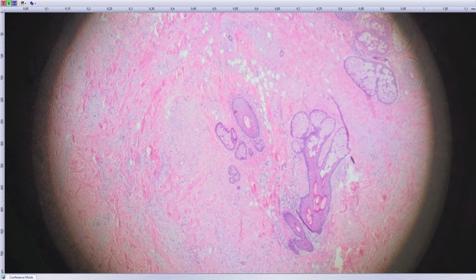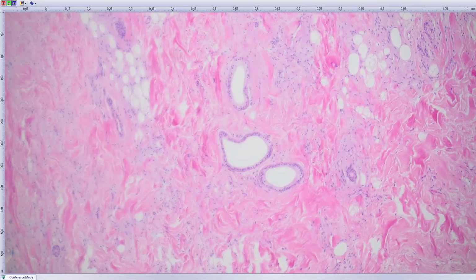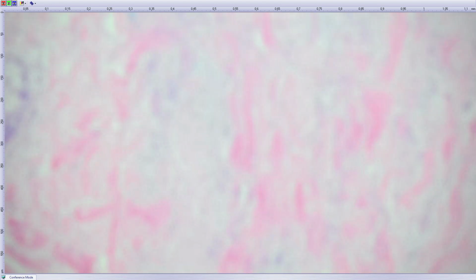It is, you see around it spindle cell lipoma with hyperplasia of sebaceous glands, but which is not superficial, so that you cannot call it a tumor. And the stromal lesion, you can see here, is spindle cell lipoma, and again we did RB1, which was negative. Okay.